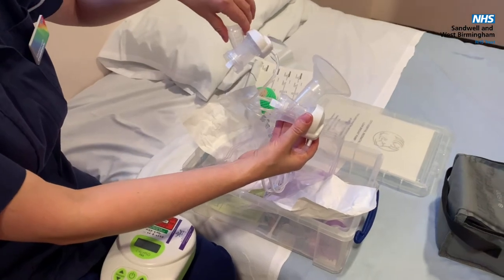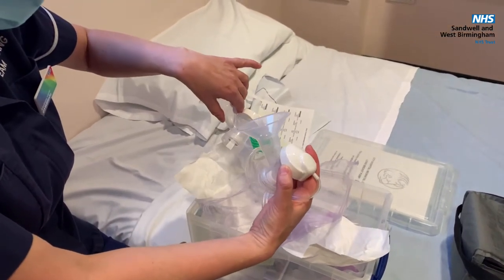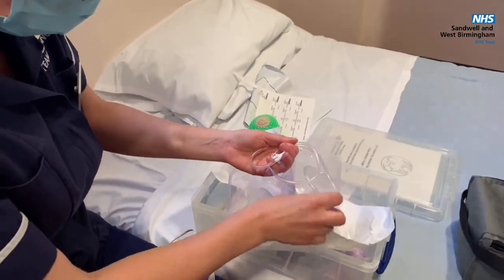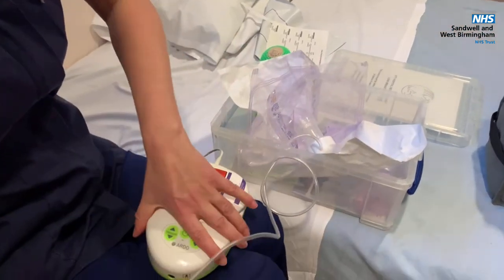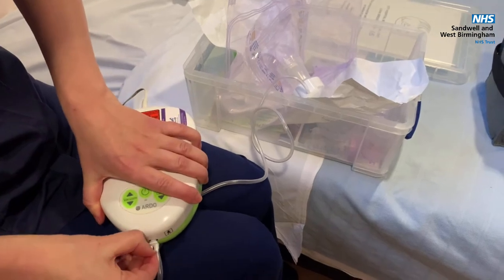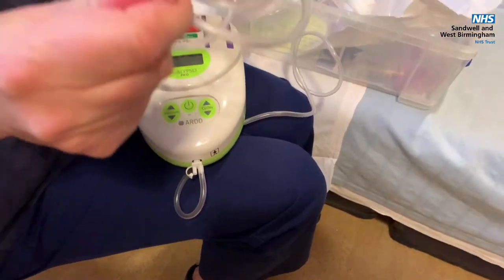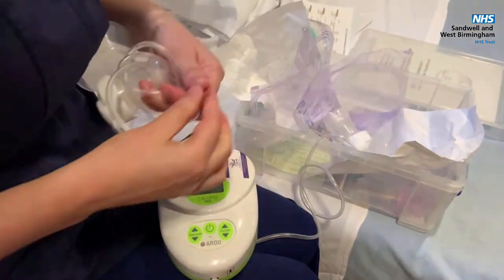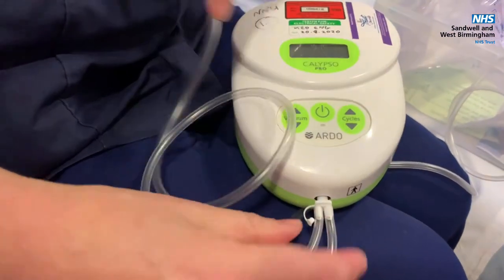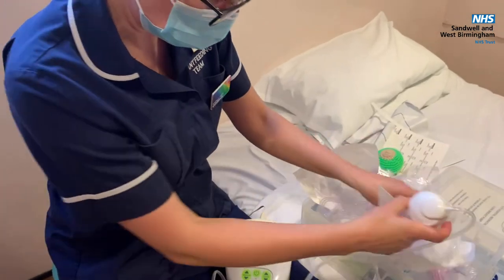You'll have two kits in your box so that you can double pump, which means expressing from both breasts at the same time. With these little pumps there's only one hole here, so to double pump put that into there, pull the end off this other hole, pull the tubing off this pump and pop it on. So you've got two kits attached to the same pump so you can double pump.